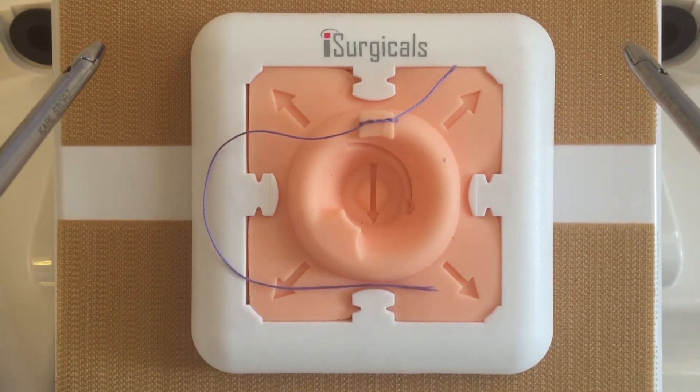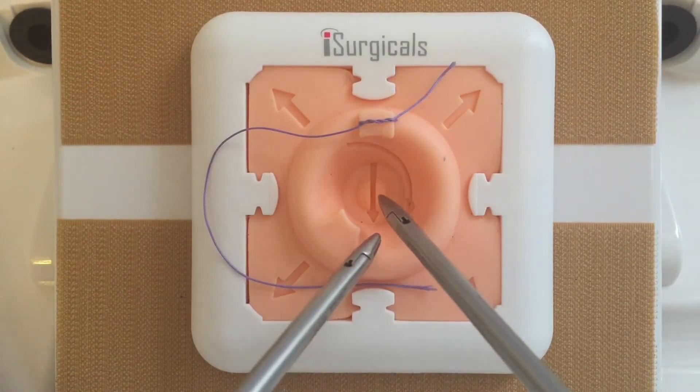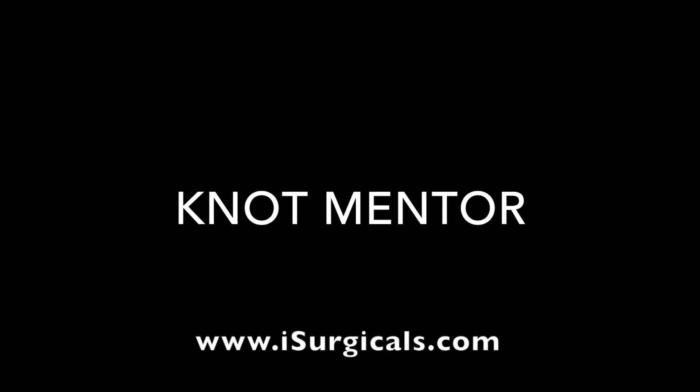The novel features of the Knot Mentor will support development of economy of movements and enhance laparoscopic knot tying skills. For further information, please visit our website at iSurgicals.com.